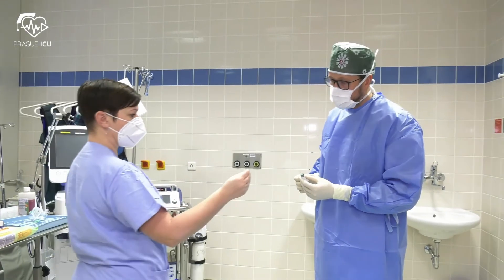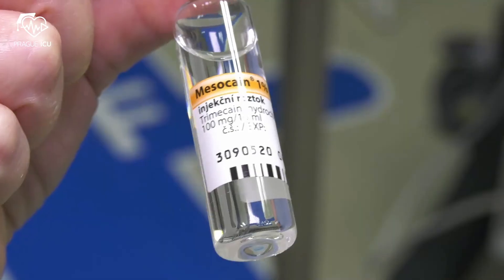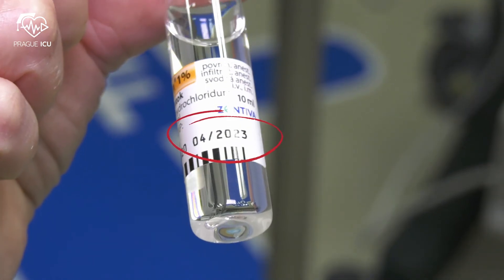Before draping the patient, draw up the local anesthetic. Always check the expiry date.